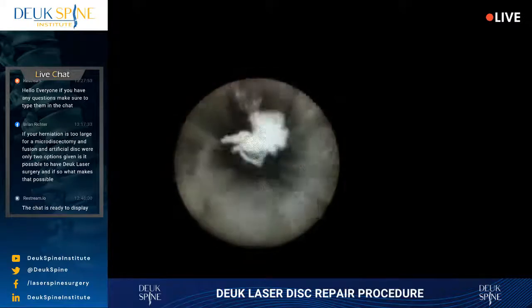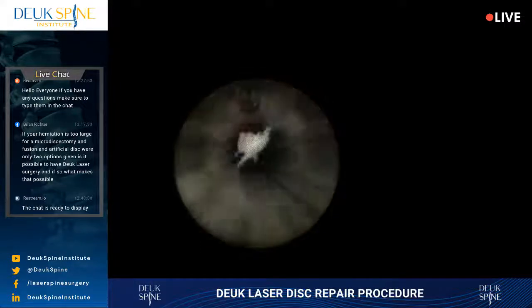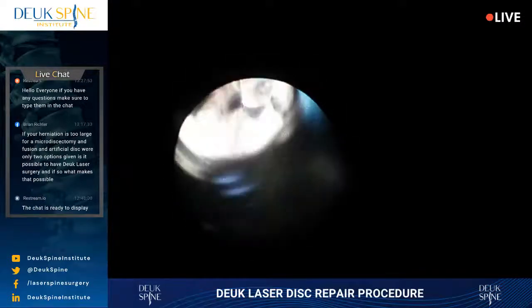Come on, come out. Little piece of herniation there. I'm just going to have to go grab it.